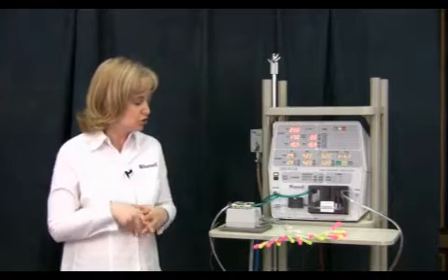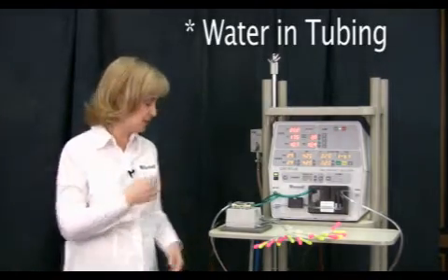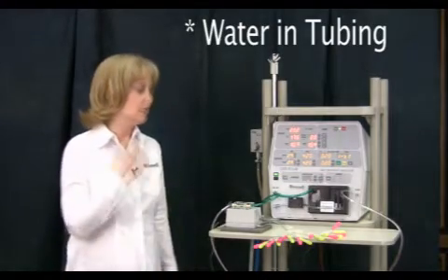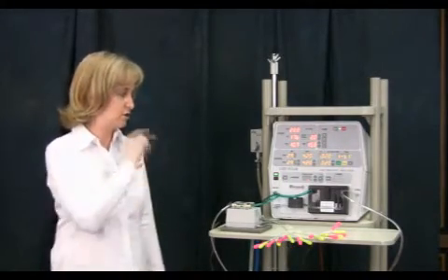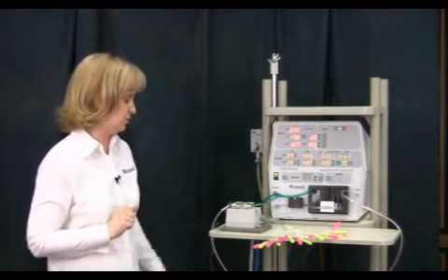The other thing that could cause your servo pressure to fluctuate is water in any of my tubing, let's say in my conventional circuit or my jet circuit, sloshing around in there. That's going to cause my servo pressure to bounce around. So I want to make sure that all my lines are always clear of water, and that bouncing is a very good indication that you could have a situation like that.